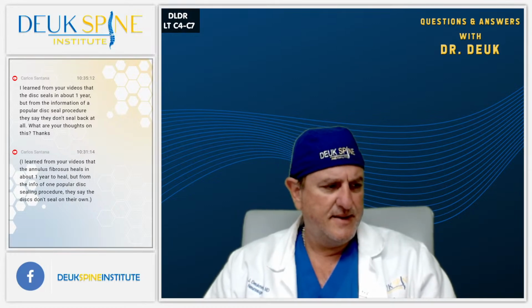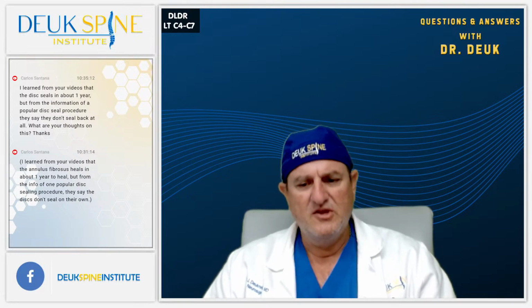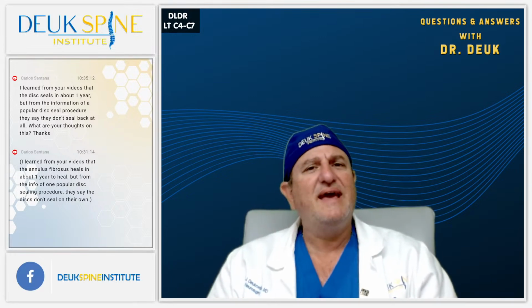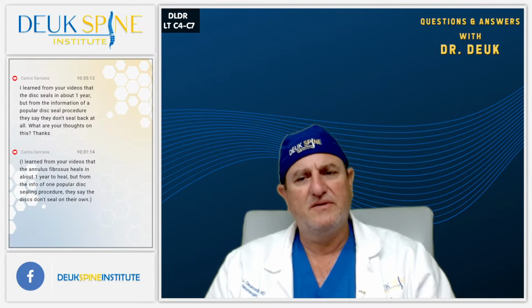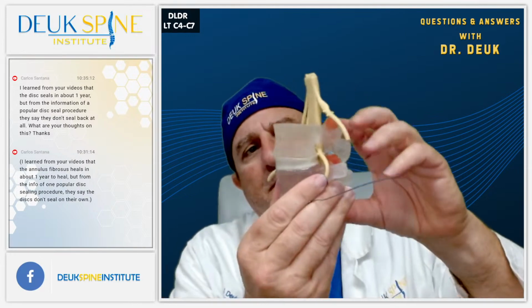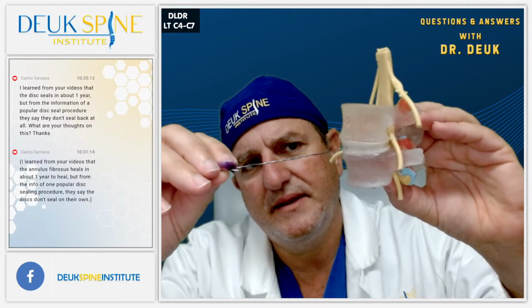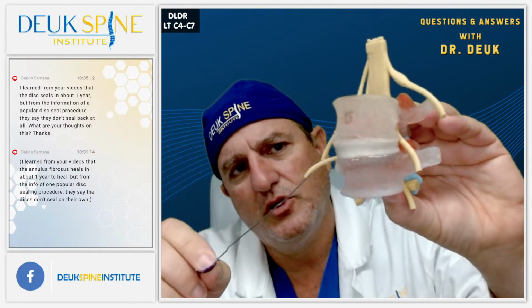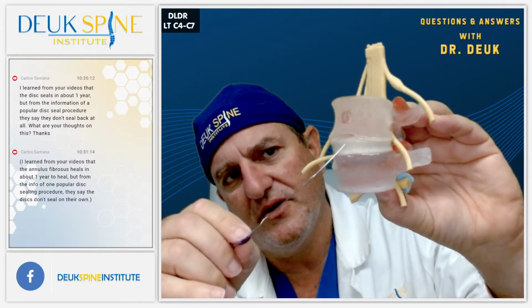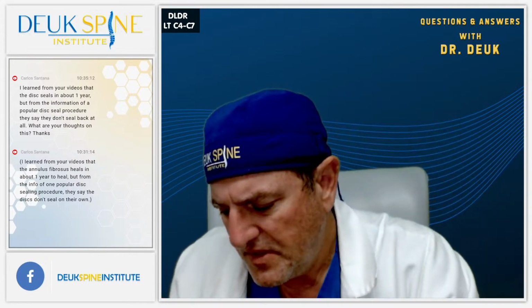They ask, when you enter the annulus with the instrument, doesn't that create a tear on the disc? So the question was, when you enter the annulus with the instrument, well, we're talking about the dilator. If you remember in the surgery, we came in through the front of the disc, right? And I penetrated. If you look carefully, you'll see there are little lines here. Those lines are fibers. So the disc has fibers.